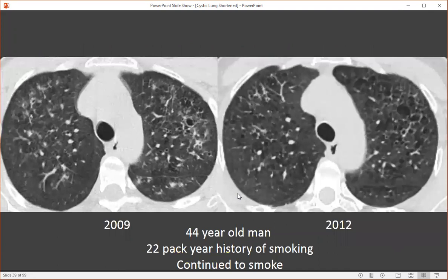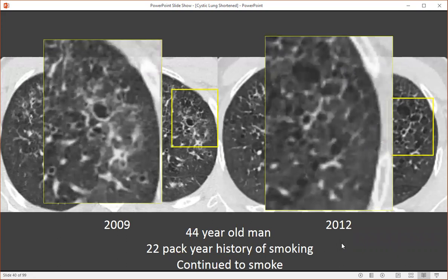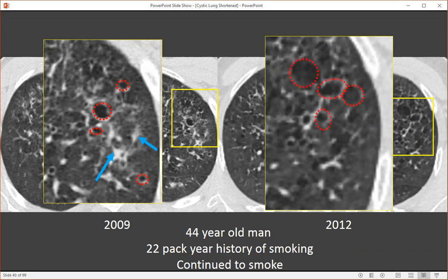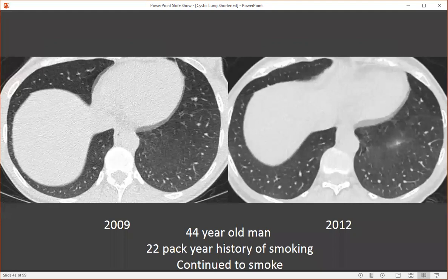Here's a 44-year-old man with a 22-pack-year history of smoking who continued to smoke from 2009 to 2012. We can see the progression of this disease, initially starting as areas of cysts in ground glass opacity and nodules. In 2012, the cysts had increased in size and number, and the nodules subsequently resolved — turning from nodules to cavities to cysts. Both in 2009 and 2012, the costophrenic angles are spared, again characteristic of PLCH. The costophrenic angles are often involved in the setting of LAM.